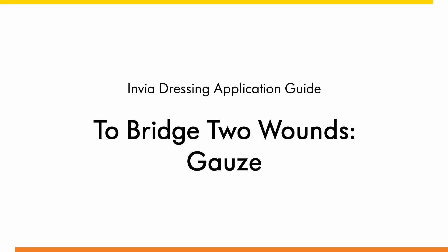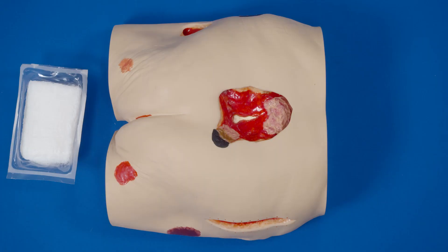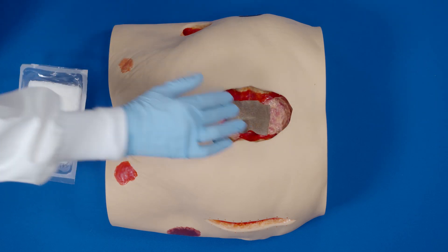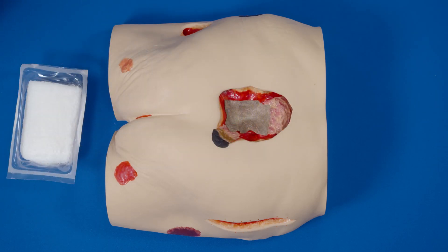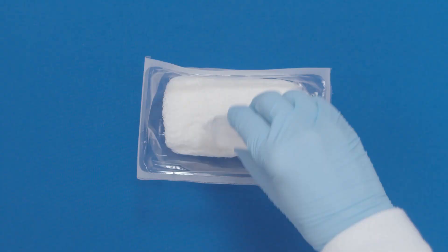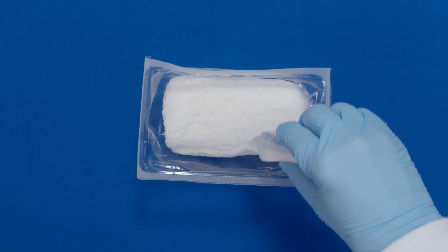Dressing application guide to bridge two wounds. Thoroughly clean the wound. If required, apply a non-adherent contact layer over bone, tendon, or other sensitive structures. Apply skin prep to protect the peri-wound skin. Saturate the gauze with the saline provided.